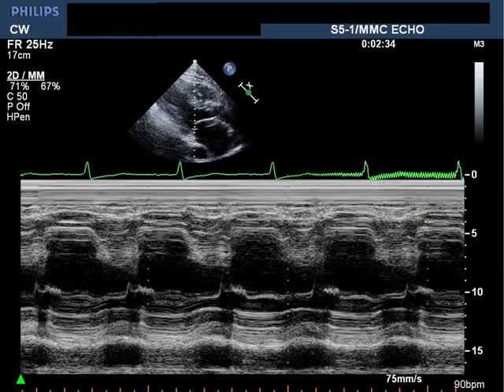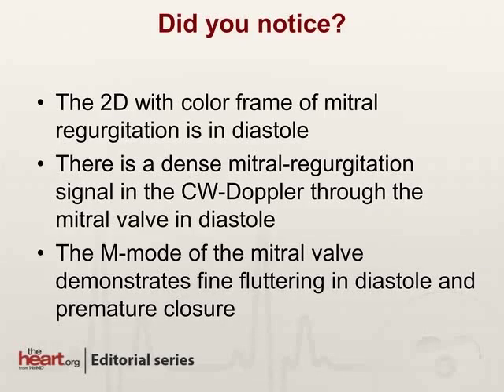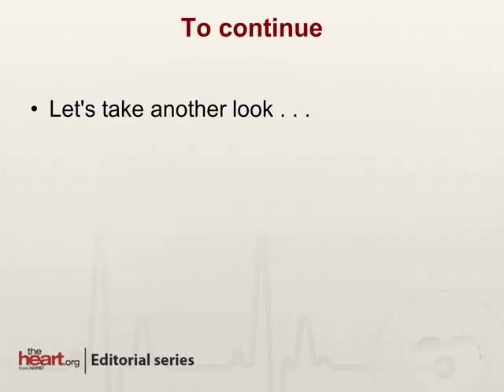However, you also see that the mitral valve closes considerably before the onset of electrical systole, by timing the closure of the mitral valve to the electrocardiogram at the top of the screen. So this is a summary of the findings: we have diastolic mitral regurgitation that is actually more impressive to the eye than the systolic mitral regurgitation, corroborated by the continuous wave Doppler and the M-mode demonstrating premature closure of the mitral valve with diastolic fluttering of the anterior leaflet.